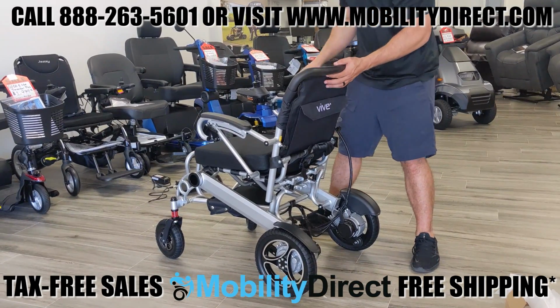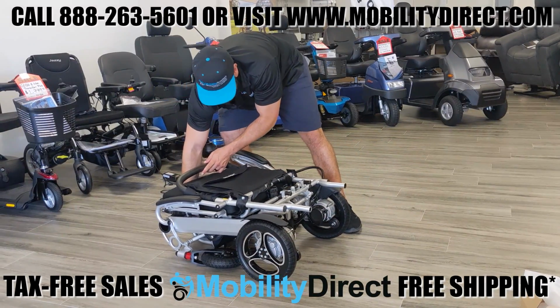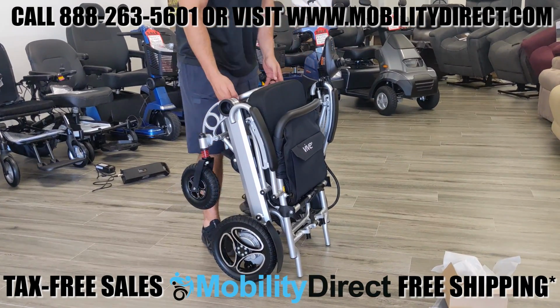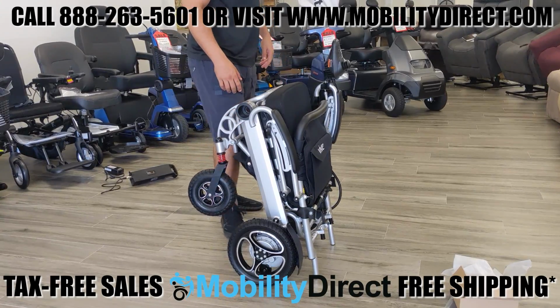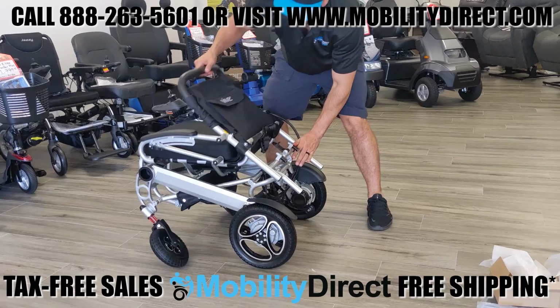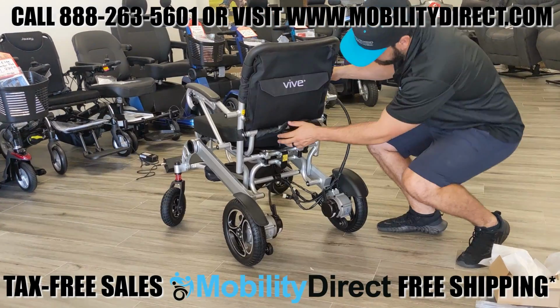When you are storing the chair in the trunk of a car, you want to make sure that the armrests are in the lowered position to make the power wheelchair's folded dimensions as compact as possible. Again, this chair only weighs 62 pounds, so it is pretty easy for most people to carry. You may need extra help if you find the 62 pounds a little bit too heavy to carry on your own.